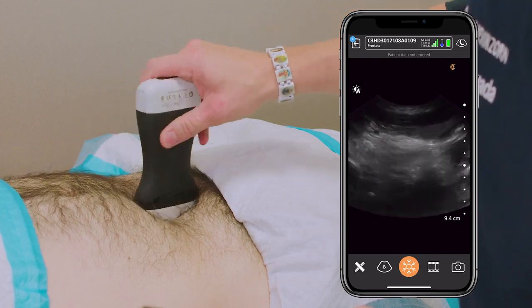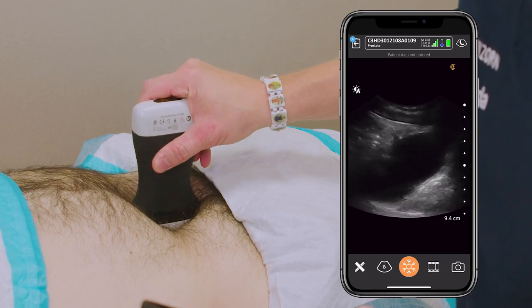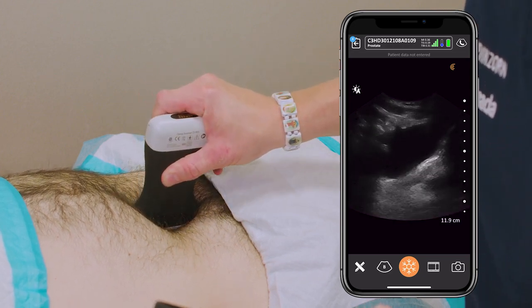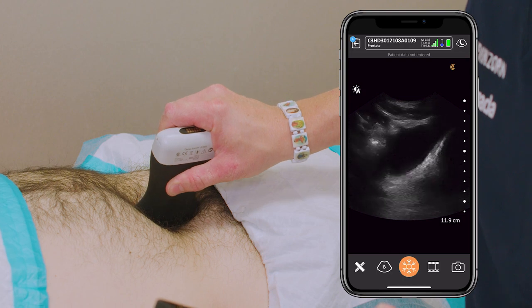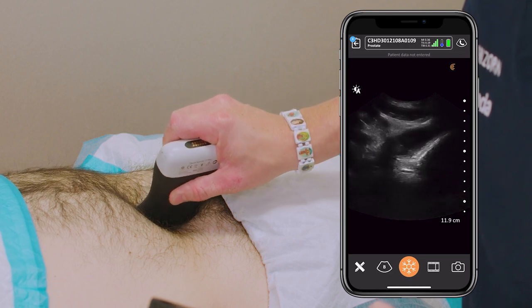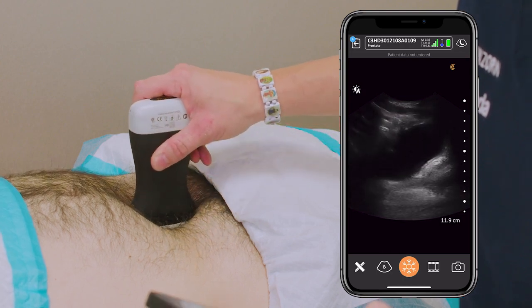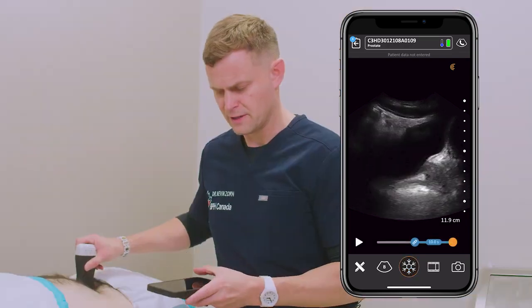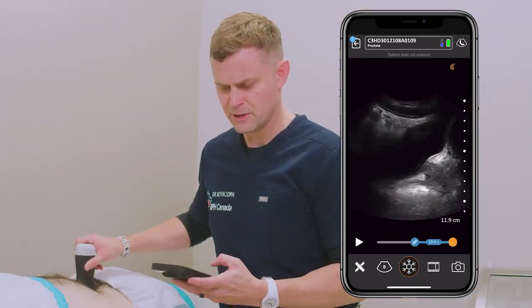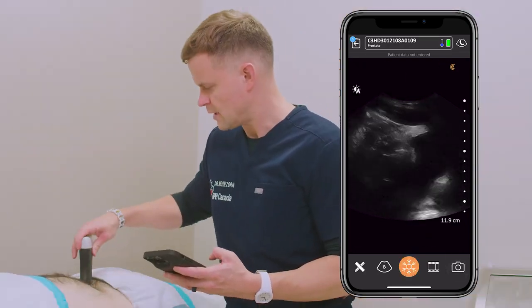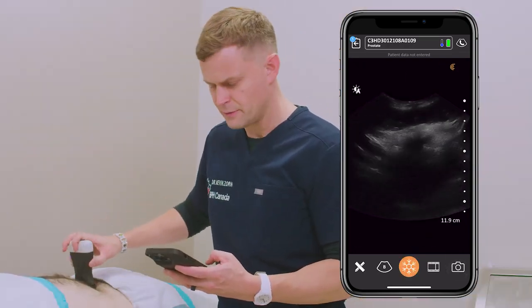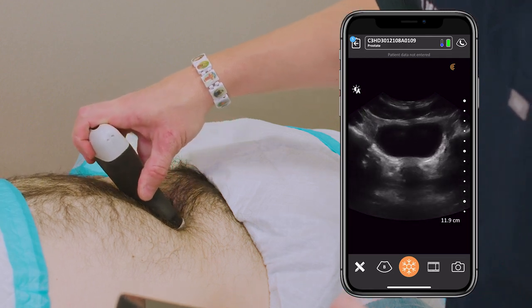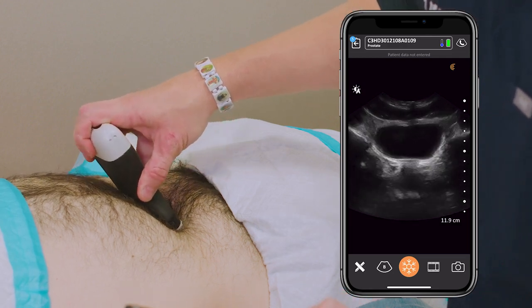We'll go sagittally and do the same views again, just making sure that there's no anterior wall tumor or defect. Clearly fanning from both sides of the bladder — clearly no abnormalities. I'll go ahead and freeze and capture that image. That's my third view of the bladder. Then I'll come back to the mid view of the bladder neck, and this begins my contour of the prostate anatomy.